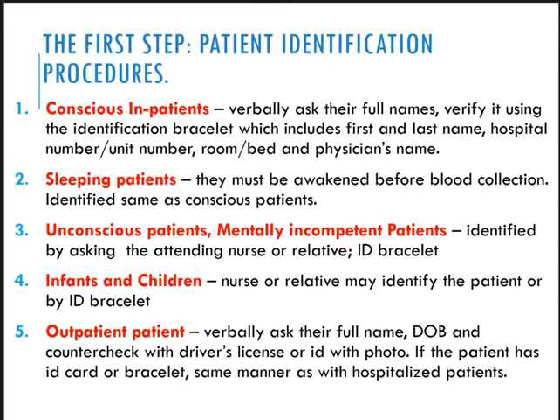Now, most of the time, wala pa ka sa ilahang bedside, gahilak na sila. So what you do is to ask the nurse or also the relative, okay? And then last we have your outpatient patient, your OPD.